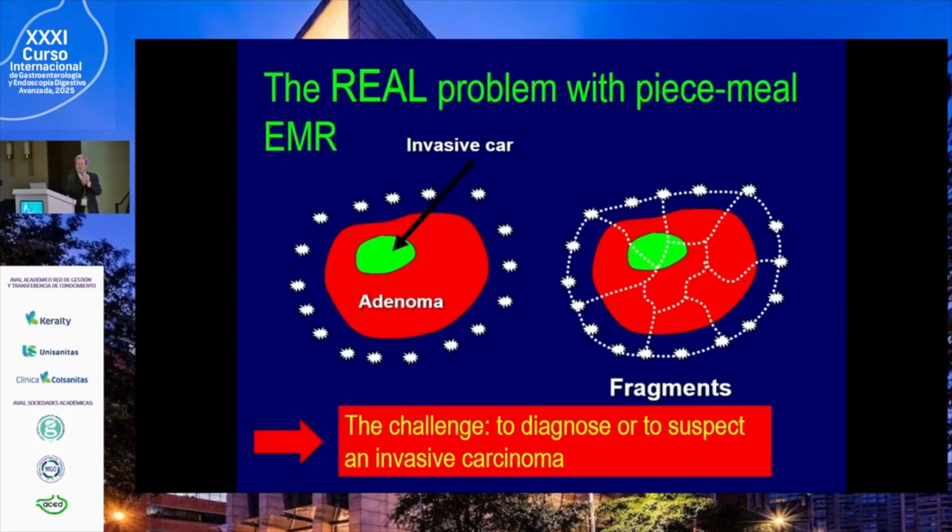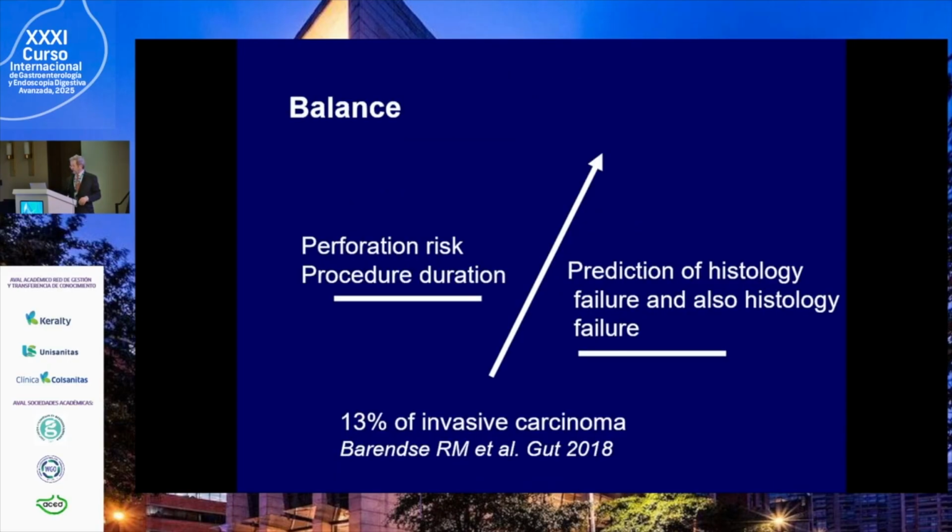Because the problem is not the risk of recurrence. This is not a problem, because you can do another colonoscopy. The problem is the risk to cut an invasive carcinoma and to destroy an invasive carcinoma. And we need to diagnose this invasive carcinoma before resection. But it is almost impossible. We have some parameters, but it is almost impossible.